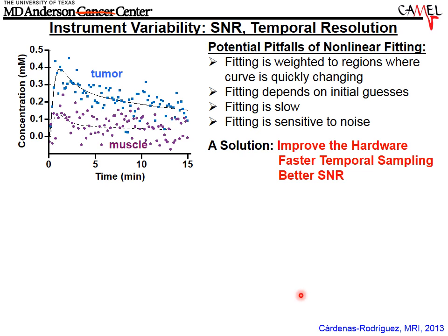And this can be used. However, with the nonlinear fitting method, the fitting is weighted to regions that change quickly, depends on initial guesses, and there's an iterative fitting method.